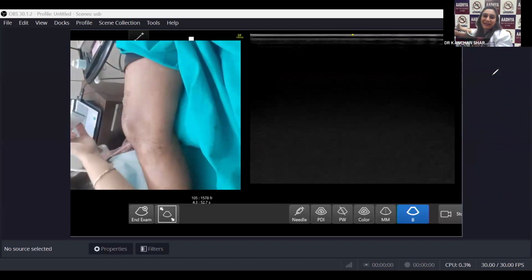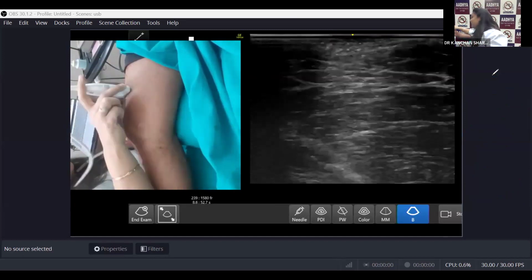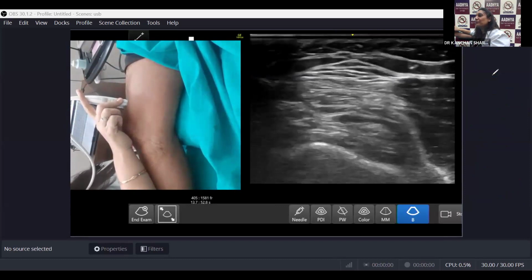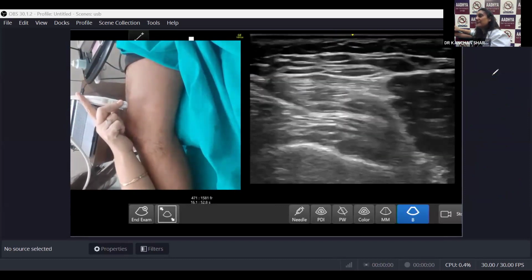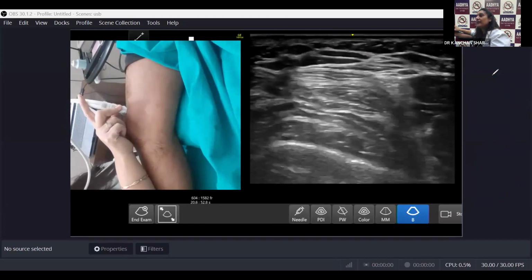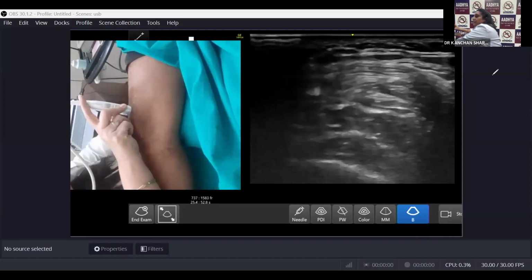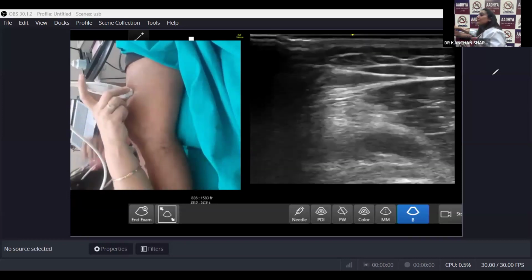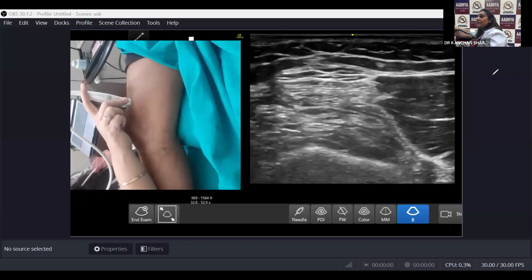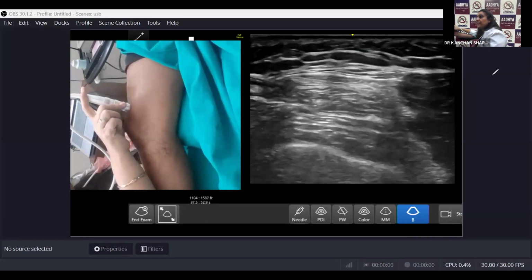And this suprapatellar fat pad hanging, it is not there in any of the books, right? It is just that once you practice, sometimes you feel that this is much easier than anything else. And this is how I have realized that this technique is much better than the other one. So if he has done the external rotation, my quadriceps has come to a different level. Okay. So now I'm just following the quadriceps tendon, okay?